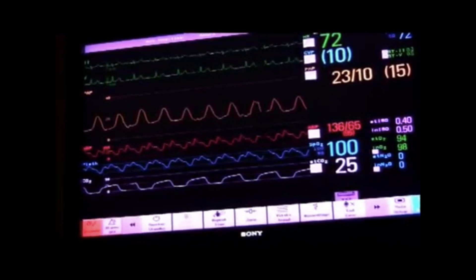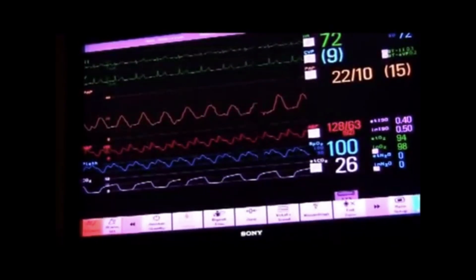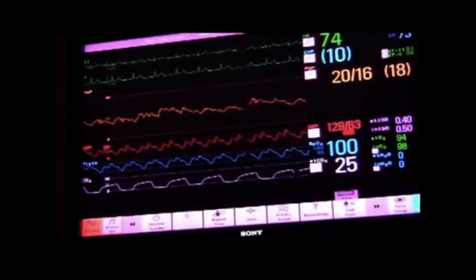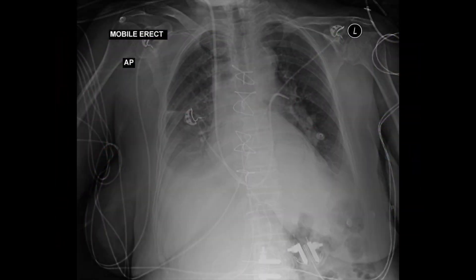Number 13: You can then see the different waveforms depending on the catheter's location. Number 14: After completion of the Swan insertion, a chest x-ray is done to confirm the placement of the catheter.